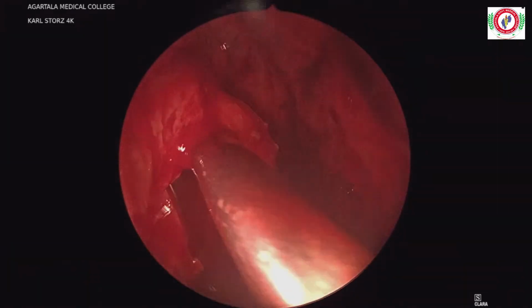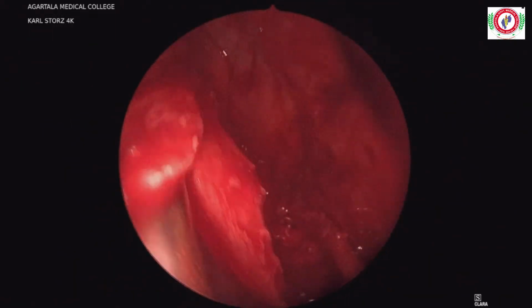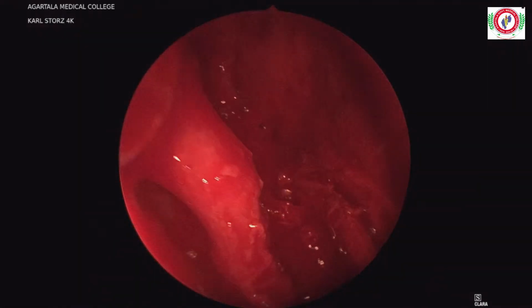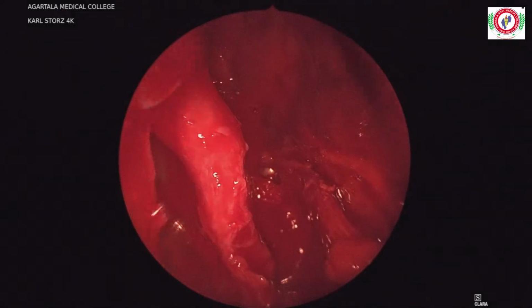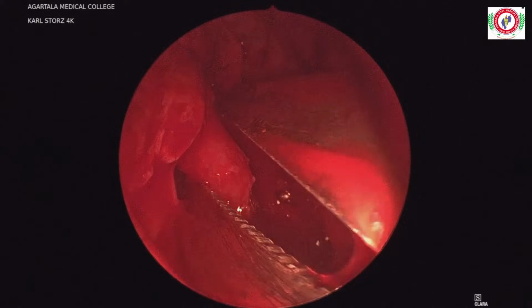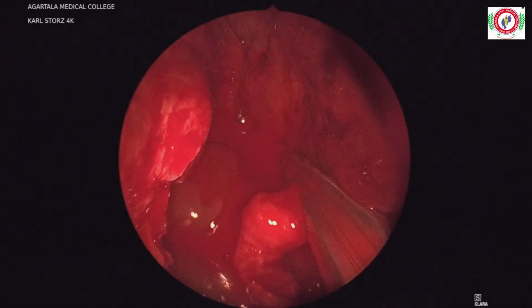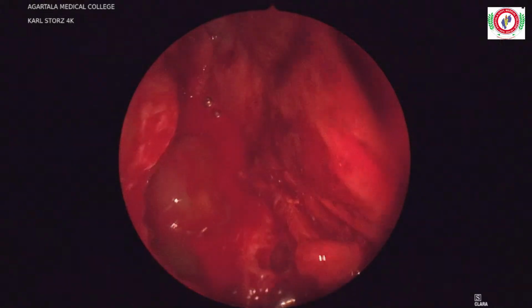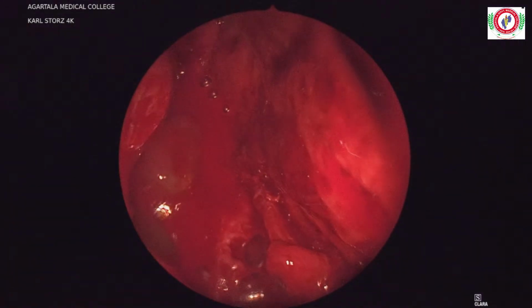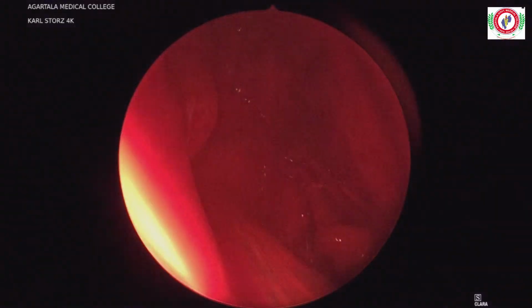Elevator. So what I can do now is either a modified Denker then, and that is most likely my nasolacrimal duct. Okay, so I'll cut it superiorly and then I'll remove this bone. Scissor. Okay, so we have to cut it superiorly and cut it sharp. Okay, that's all.